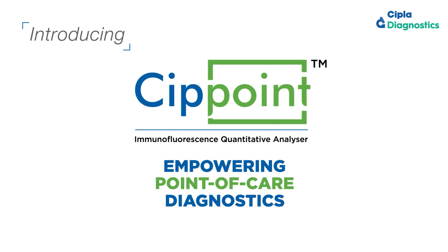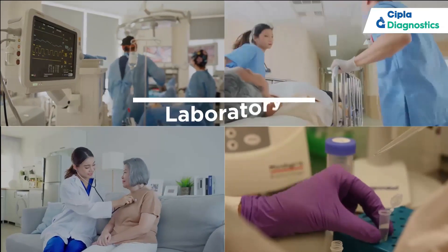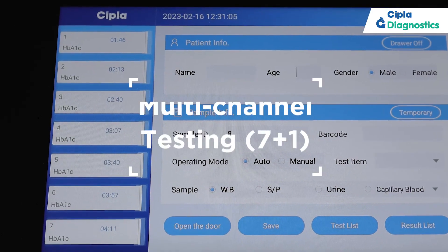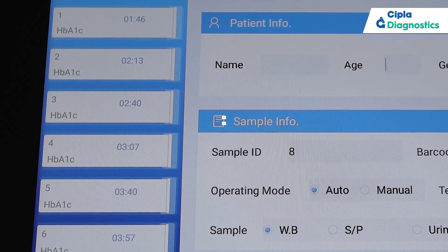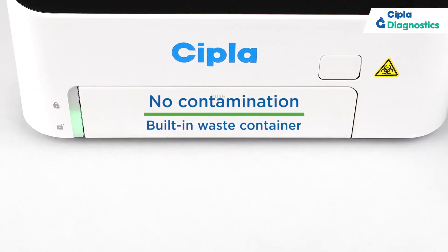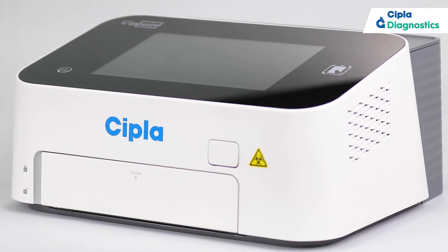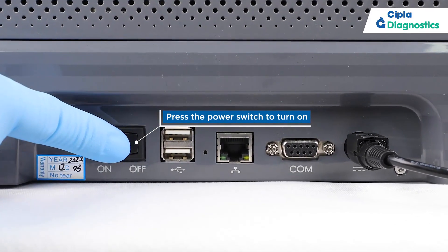Empowering point-of-care diagnostics that provides expedited, accurate and reliable results in multiple settings. Along with maintaining a constant temperature, doing multiple tests at once, and assuring zero contamination between samples for a broad range of diagnostic tests with an array of samples — in a simple, foolproof, step-by-step process.